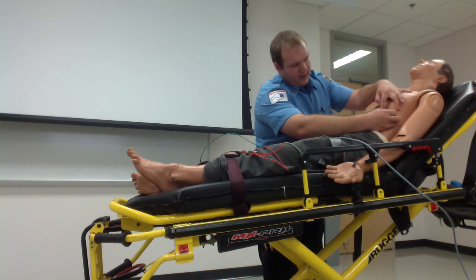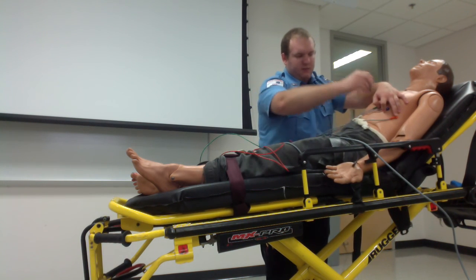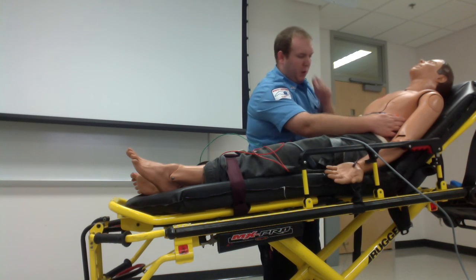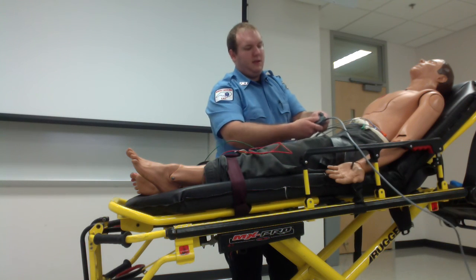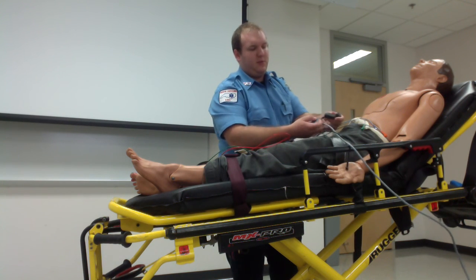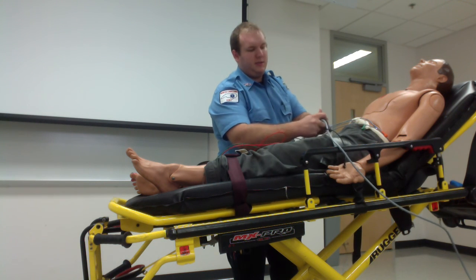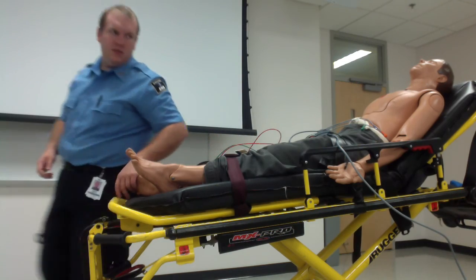V5 you can put right in line again. Make sure you palpate the right spot. And then V6 will go right beside V5, in kind of the middle of the underarm. Once you've got that all applied, you will plug it up. Your box should be somewhere along the set of your 3 lead wires, and you just plug it in. Once you plug that in, your monitor should automatically switch.